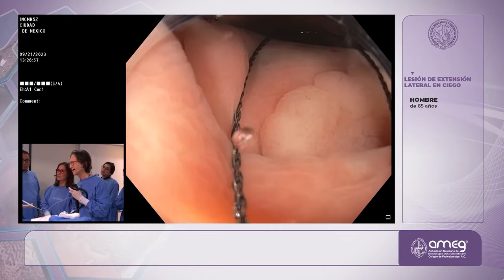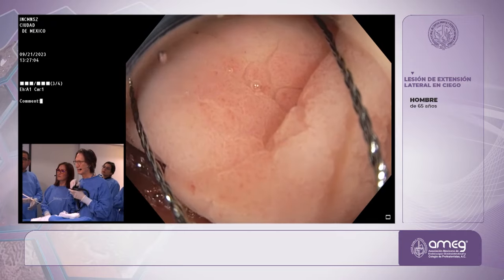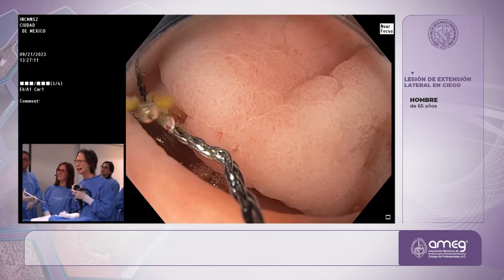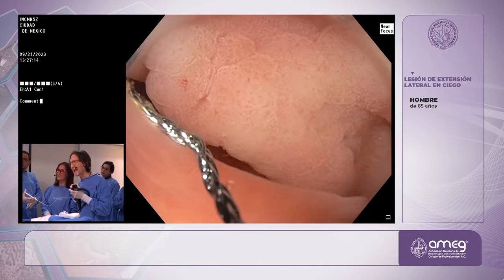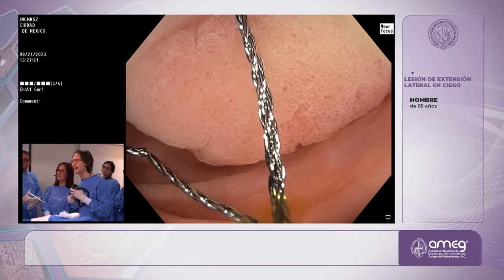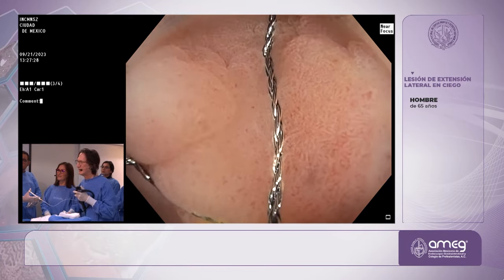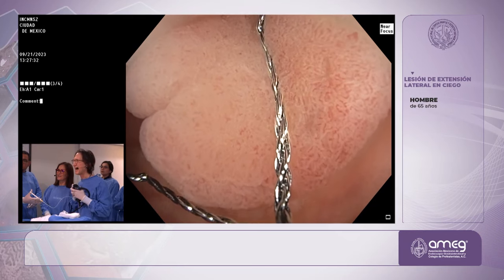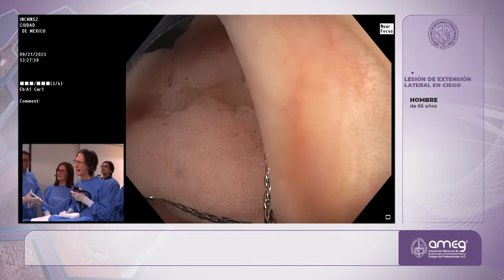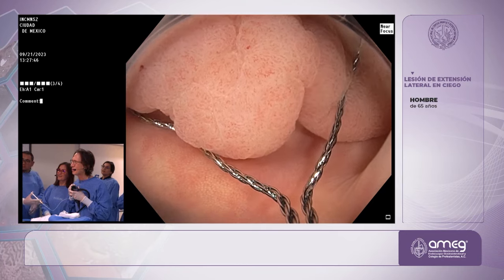Okay, hold the scope here, please, for a second. So here you can see this area here. And put the near focus on. So this takes patience. And I'm going to do my best to scoop it. So what I'm doing is trying to get that overhanging part to scoop in. Now the challenge, I think with the 33 I could do it. I don't think I'm going to succeed with a 25. But the idea is to get this whole thing to float up inside of the snare. And I'm going to do my very, very best to make that happen. There it's scooping over this way, holding this position. I don't know that I can get it all the way over to the right side.